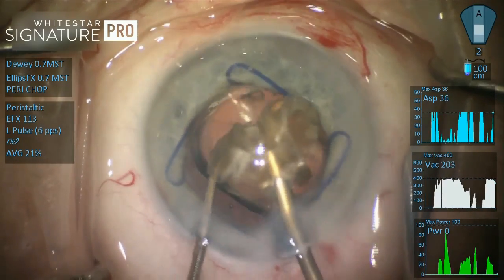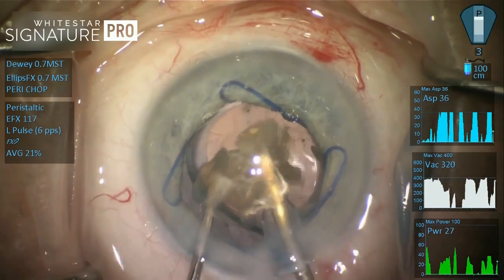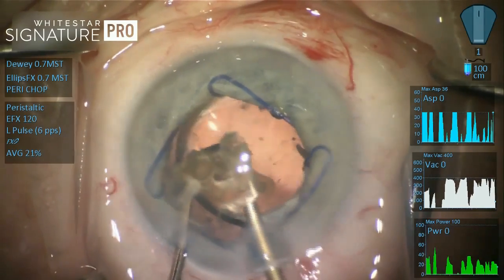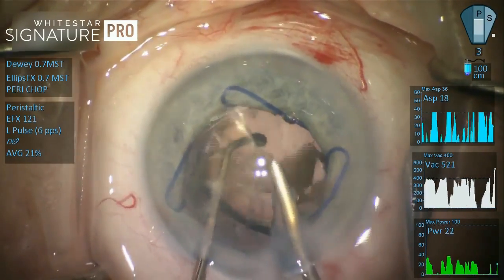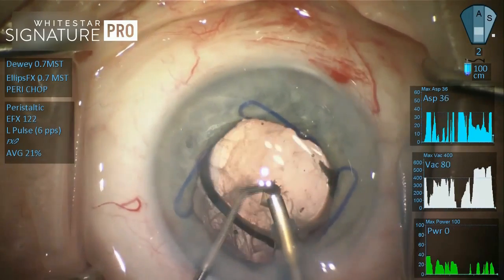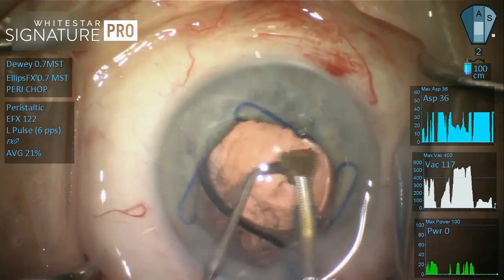So this nuclear fragment on the anterior surface of the lens, we're trying to be very gingerly, and we don't want to etch the anterior surface of the lens. Of course, I have a rounded chopper, so that's probably not going to cause any problems. I've got a rounded phaco needle. Again, we're just providing very small bursts of power. We're confining our work to just the very surface of the lens, and this material is just disappearing in the lumen of the needle, and the corneal endothelium was very well preserved.